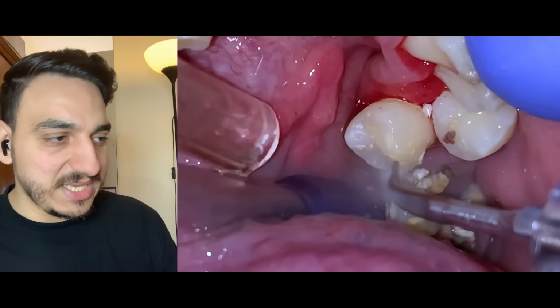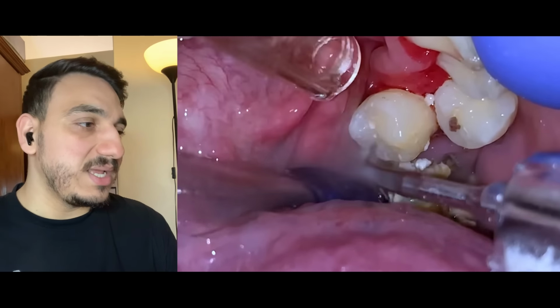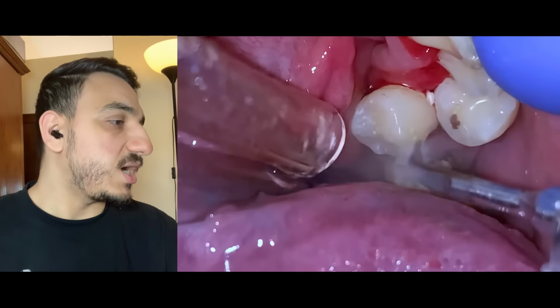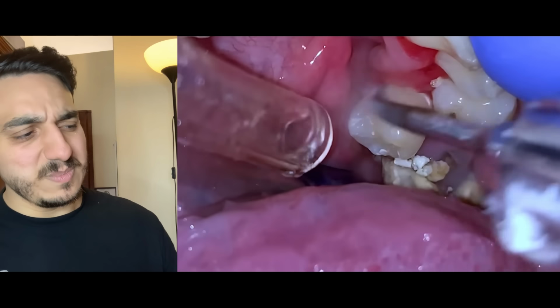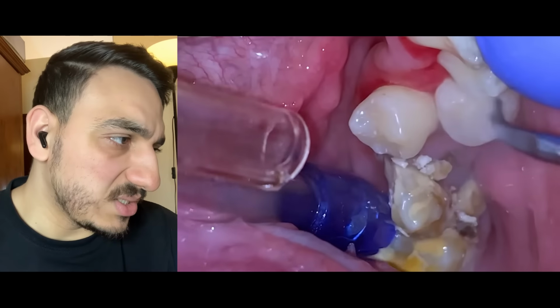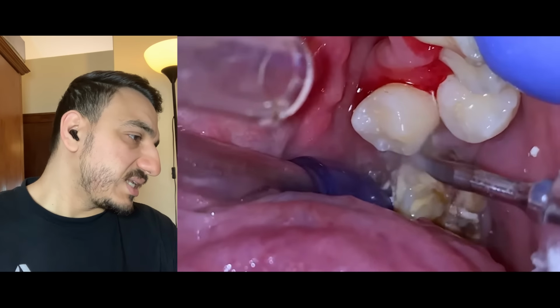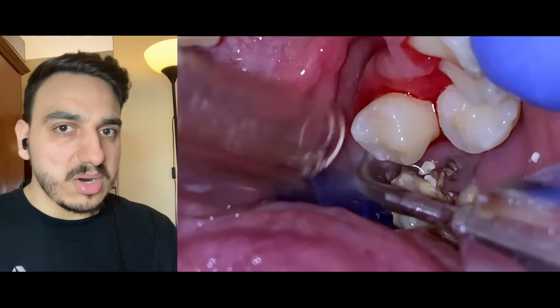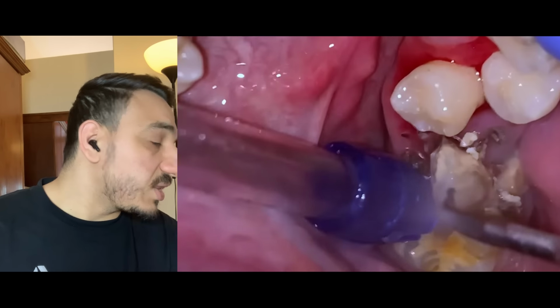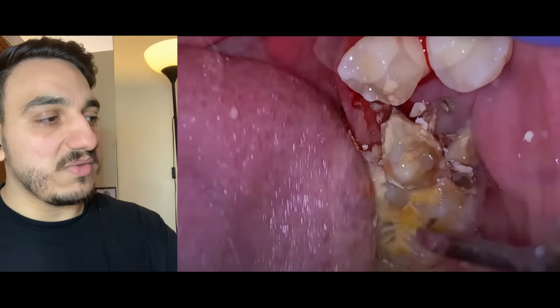Yes, of course, I see cases like this, but that is really a huge piece of dental calculus. I would say this is a moderate to severe case of dental calculus accumulation, more towards severe. But look at how clean the teeth can be underneath all that dental calculus.